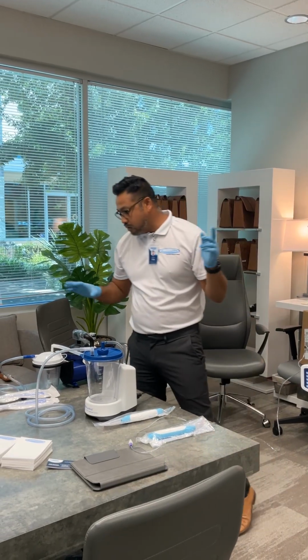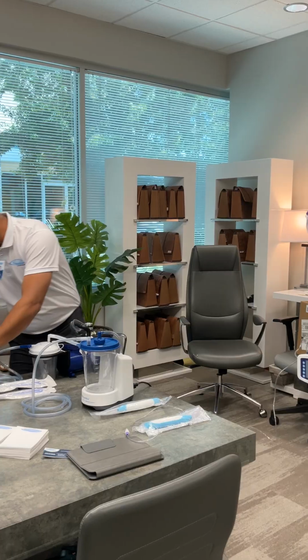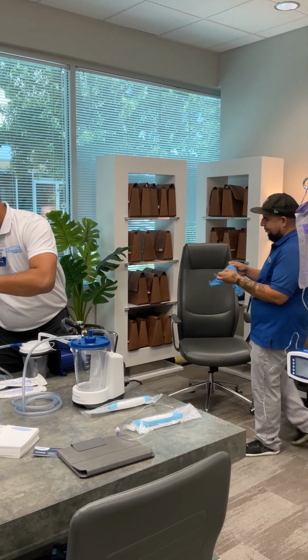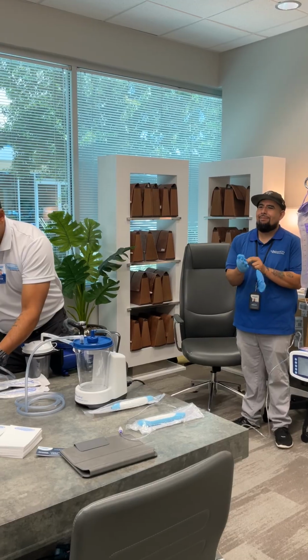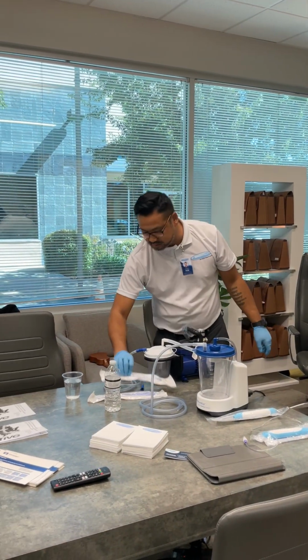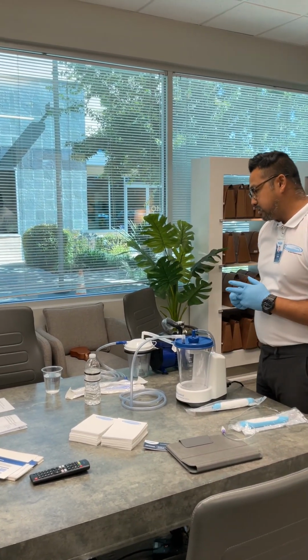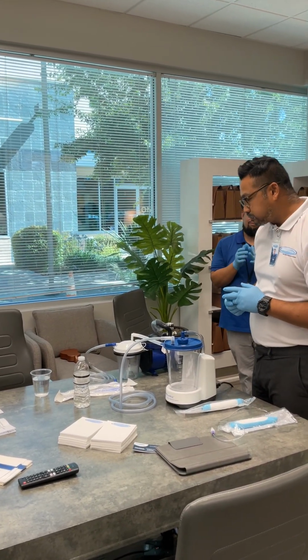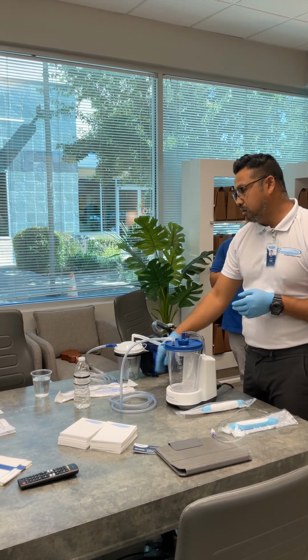He's going to go over oral suction. You guys have probably already seen this in the field. That's what it looks like, and he's going to demonstrate via these Yankauer ones, these bulb tip ones, and it's vented. Yes, it is. We do have other kinds of suction, so there's gastric suctioning, thoracic suctioning. This is oral.